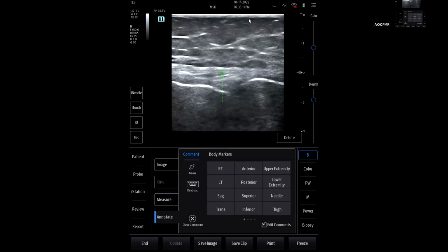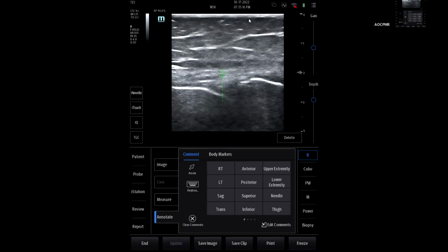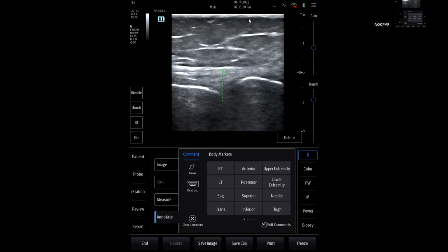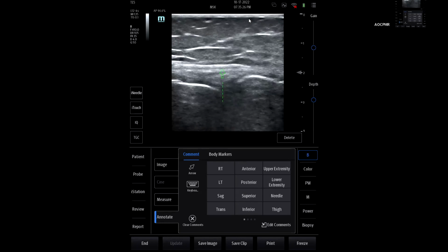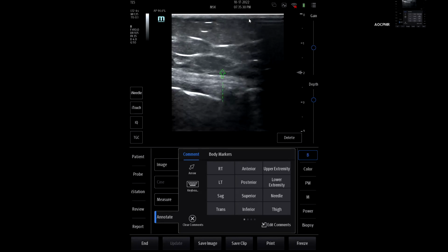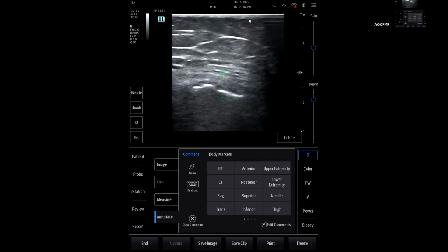And if I wanted to do dynamic testing, if I'm very clever, I can try and do a valgus stress test to see if I can provoke any movement here. And she's not moving at all. She's not budging. Just a little bit, but you see that moving? That's not moving at all. So if I found some laxity on exam, I could throw the probe on and see what's moving exactly.